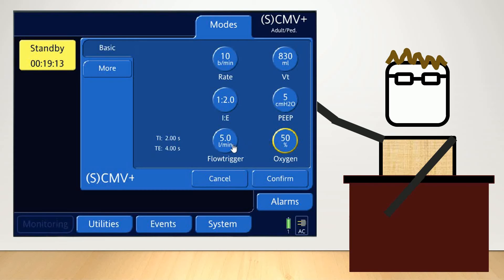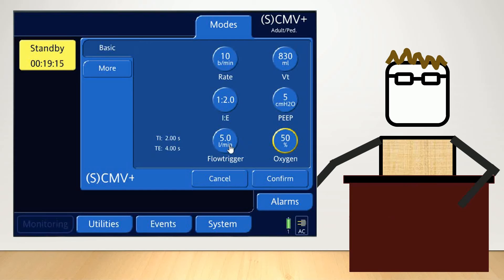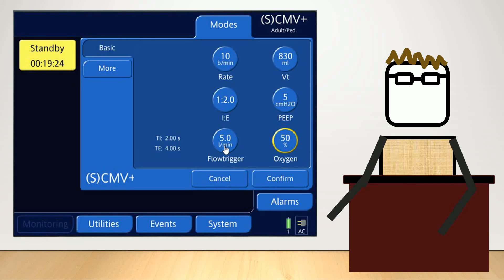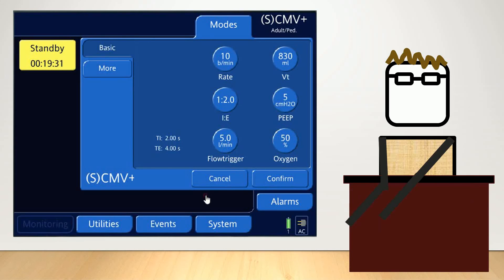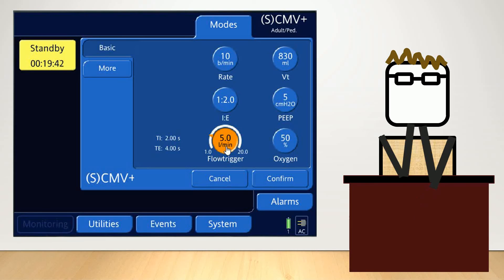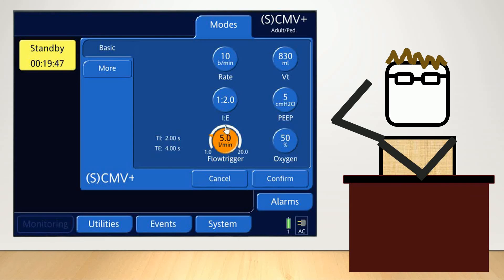If the patient is going to be assisting their ventilation, then you may need to adjust their flow trigger. The flow trigger is the threshold the ventilator will accept from the patient as an indication that the patient is trying to take a breath. Usually this is set for flow at around 5 liters per minute, and for ventilators that use a pressure trigger, this is usually set at minus 3.